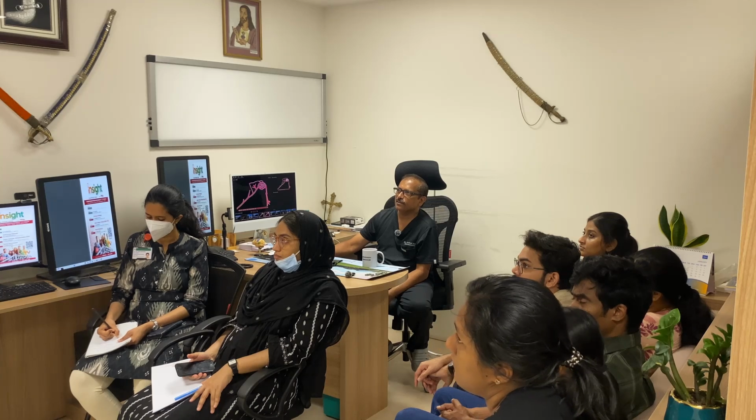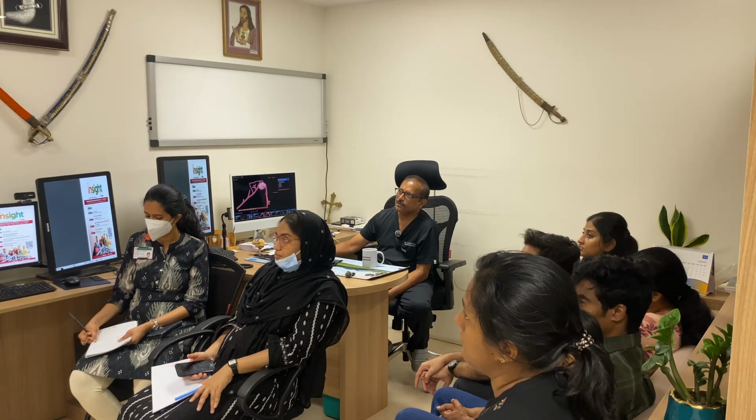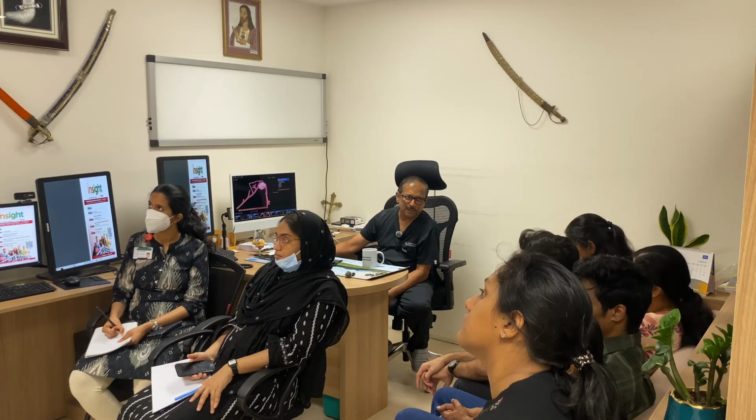So first we have to flush this microcatheter with a non-ionic solution like dextrose. You flush and prime the microcatheter with dextrose. Then you inject the liquid agent. It starts solidifying inside, so it will produce a total occlusion of the nidus.